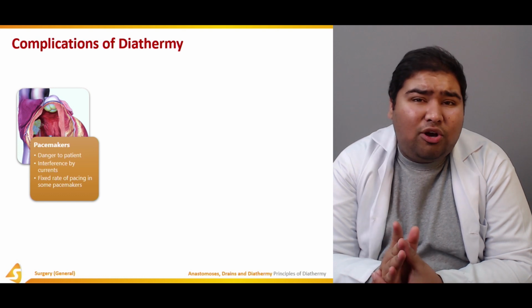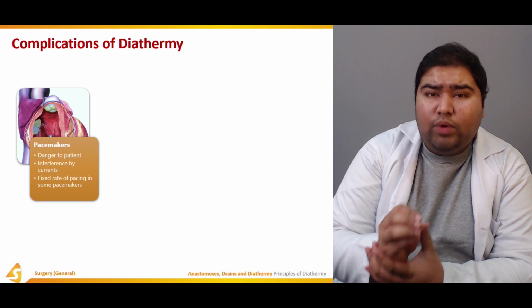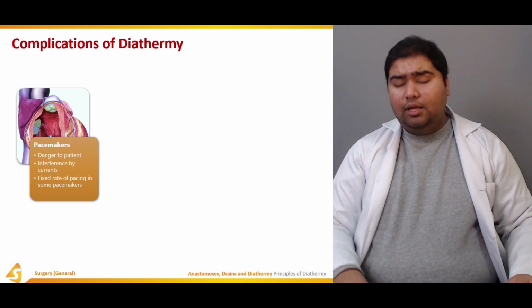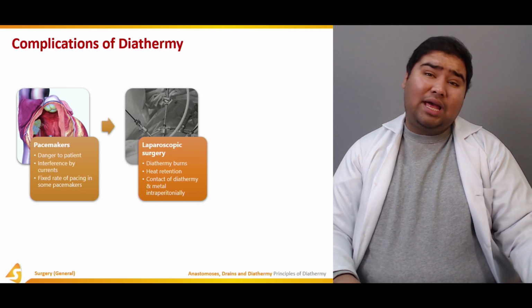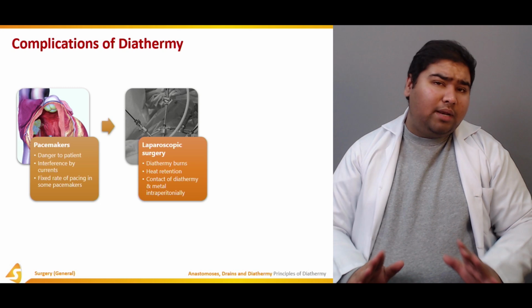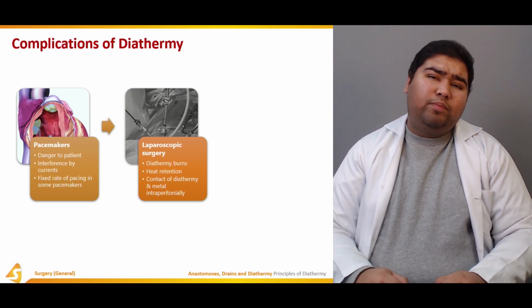Your anesthesiologist must always be prepared so that if there is any problem with the pacemaker, he might be able to resuscitate and restart the pacemaker and resuscitate your patient as well. So during a laparoscopic surgery, the diathermy can be hazardous. Why is that? You have a very small view of the field in laparoscopic surgery.